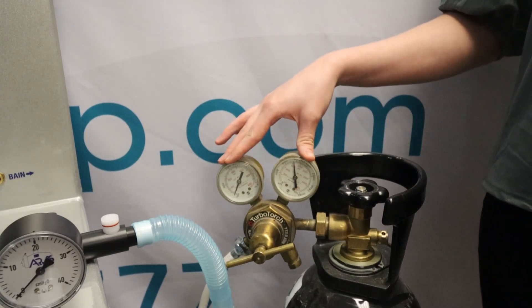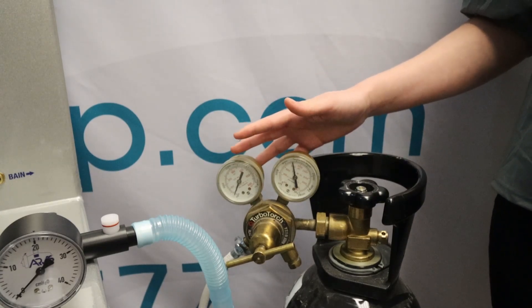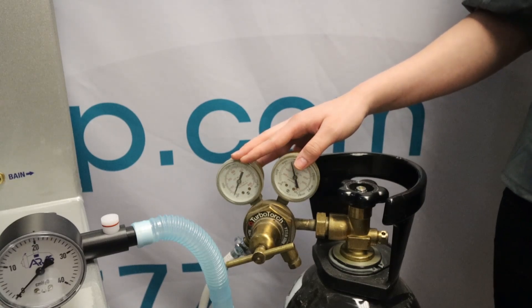If you do not have a dual gauge regulator, you will not be able to perform this test. If you're concerned that you may have an oxygen leak, please seek professional help. Pure oxygen can be dangerous.